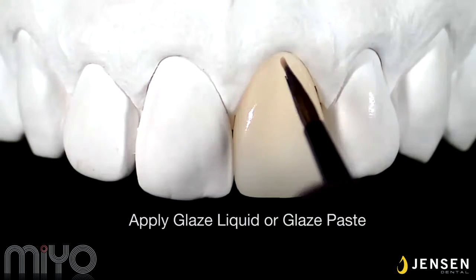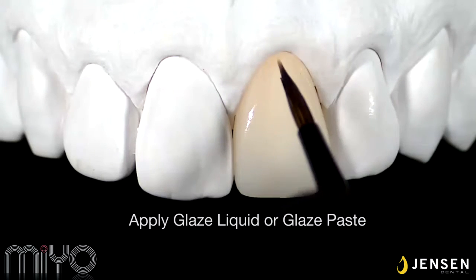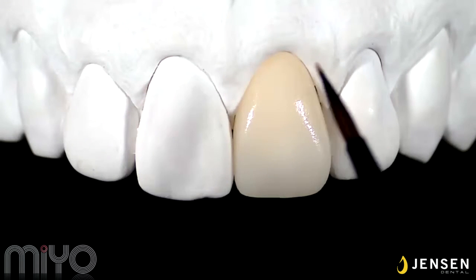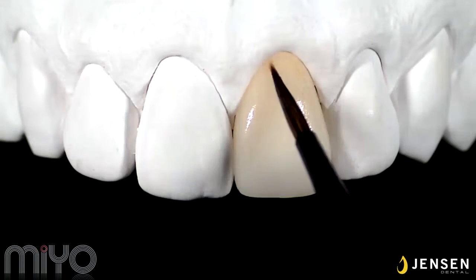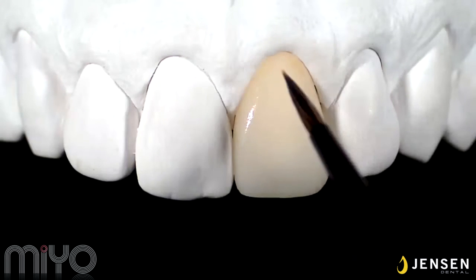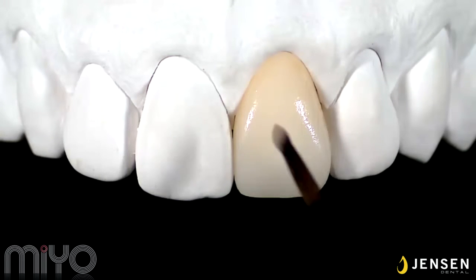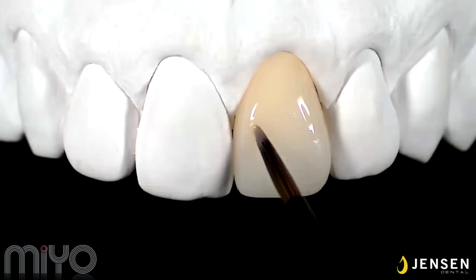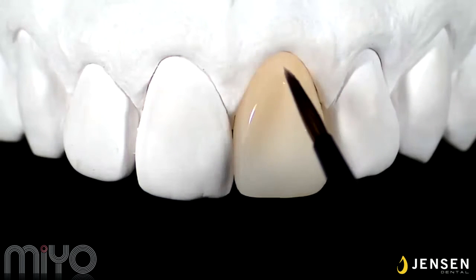First, it's important to apply a very thin layer of glaze liquid to break the surface tension and for the colors to flow easier. Translucent clementine was used for the chroma near the gingiva region. All translucent bottles in MiYO add color and translucency without altering any value. Translucent straw is applied for the body 1/3. Avoid brush strokes at all times. The most optimal way of applying colors from MiYO is to dab and drag, like opaque application.